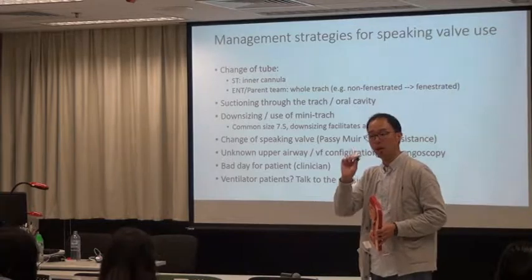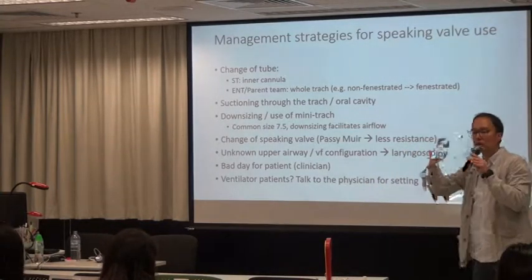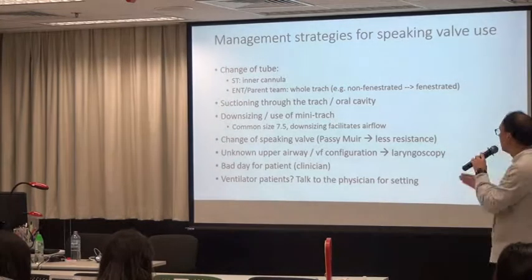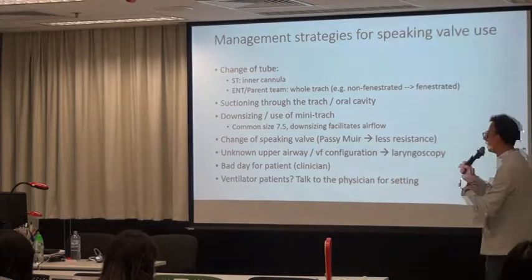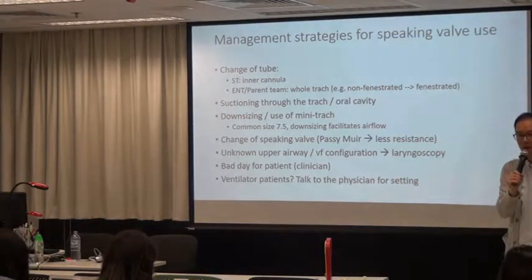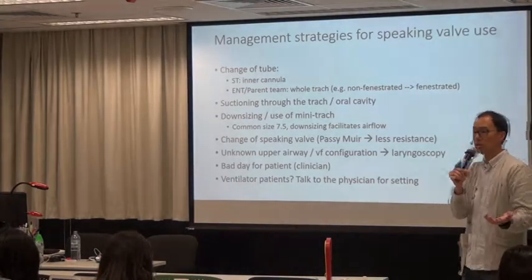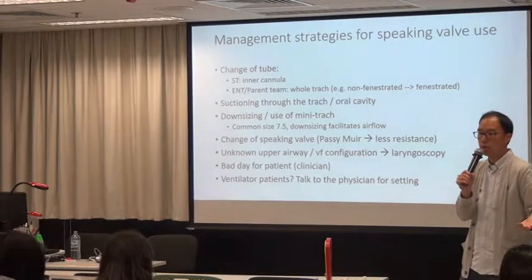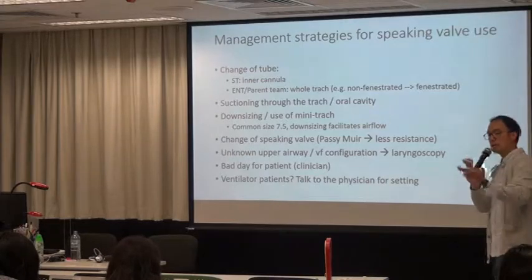就係我哋做嘅，patient 自己都可以做。但係 if you have to change the whole tracheostomy tube, you have to ask the parent team to do it. Okay? From a non-fenestrated to a fenestrated tube. Okay, it's going to facilitate speech. Okay, I'm not saying that it definitely is going to make the patient be able to talk. Okay, sometimes it's just not that way. Okay. 另外咧，就 another thing is to suction.